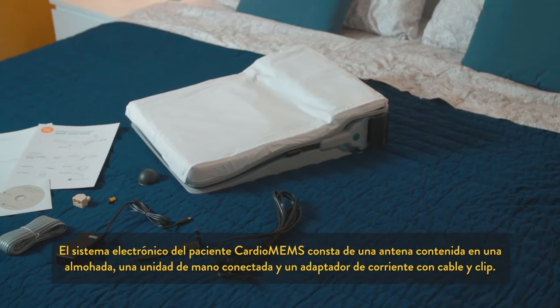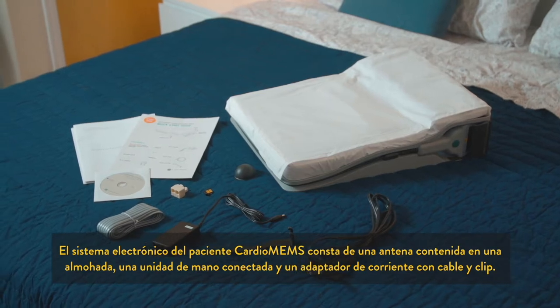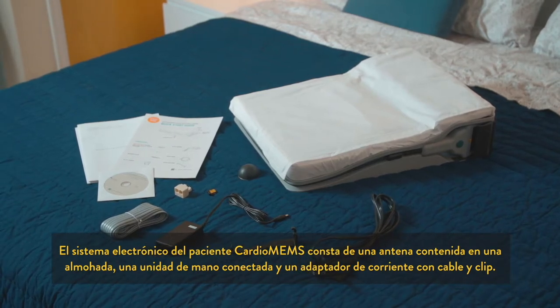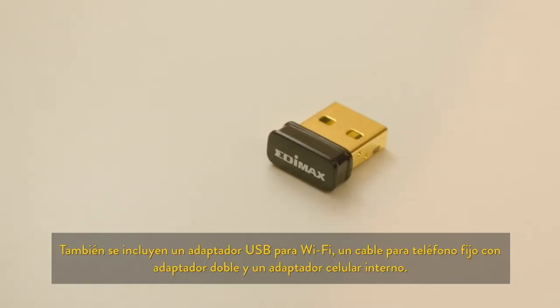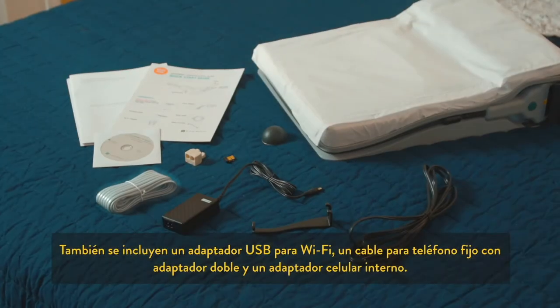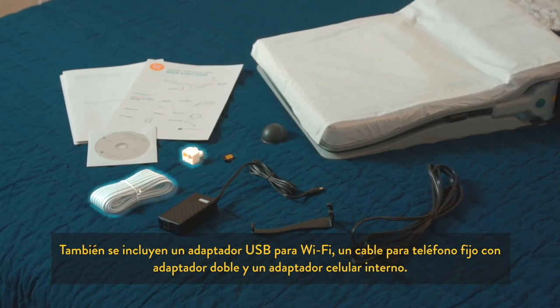The Cardio MEMS patient electronics system consists of the antenna contained within a pillow, a connected handheld unit, and power adapter with cable and clip. Also included are a Wi-Fi USB adapter, landline phone cord and splitter, and an internal cellular adapter.